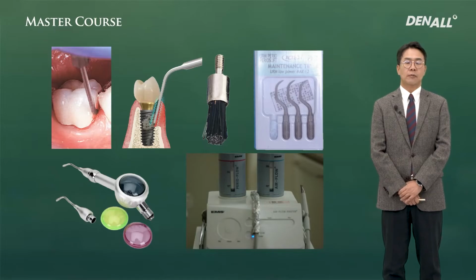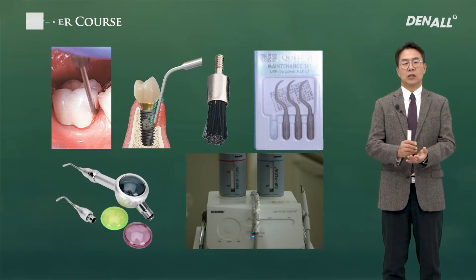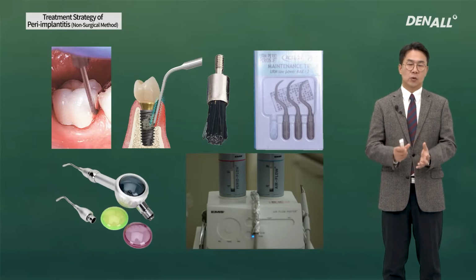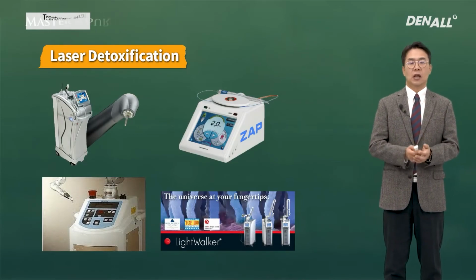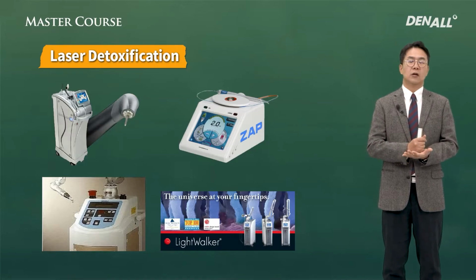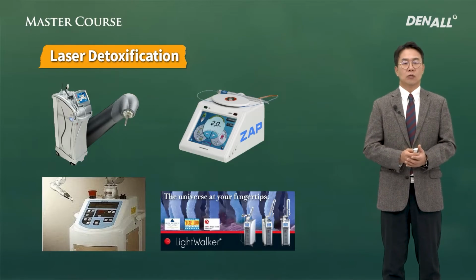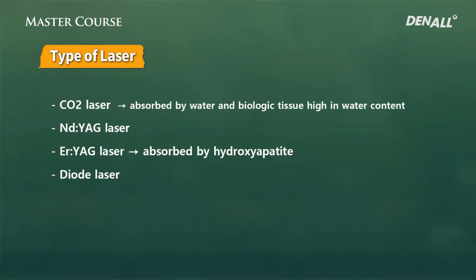Scaler is the most notable mechanical cleaning way. You can use air abrasion using tools or using a medium which comes in direct contact to do photodynamic therapy. As of late, different lasers are available from different companies. Different companies argue that they specialize in certain areas. However, clinically, it has not been proven clearly as of yet. The price of lasers varies significantly from very expensive to more affordable.